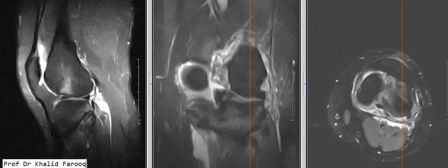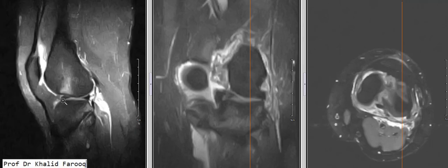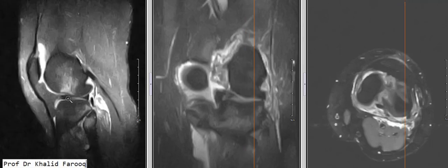Here in sagittal fat suppression T2 weighted sequence, we can see there is mild osteochondral impaction injury of mid-anterior articular surface of lateral femoral condyle with the bone bruising in its adjacent portion. Bone bruising is appreciated in head of the fibula and posterior edge of the lateral tibial plateau, but we can see that lateral meniscus is unremarkable.